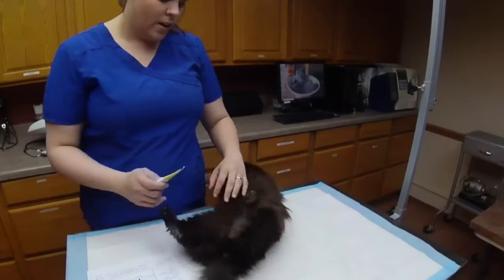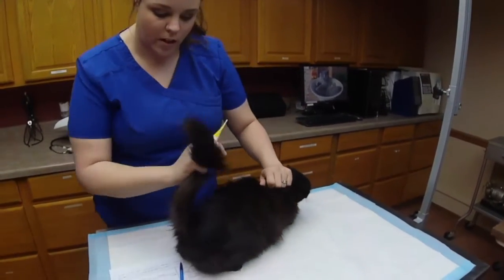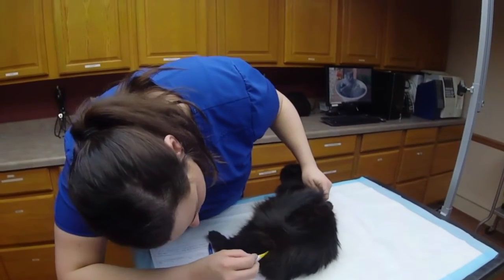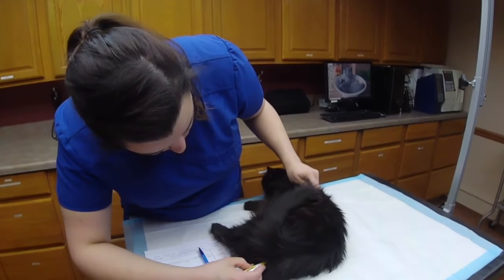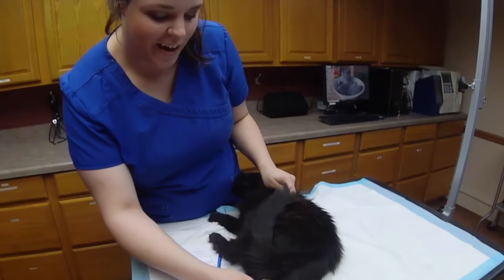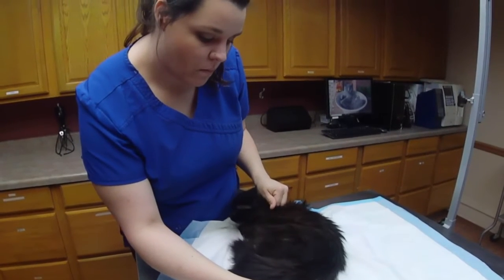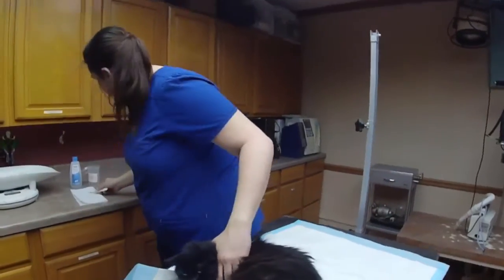Though she is friendly, this part may be a little bit stressful to her. So what you're going to do is hold her tail and scruff her. I know. Though it's a fast thermometer, it started out at 90, so we're climbing slowly. I know, Miss Samara. I can let your tail go. Oh, she is at 100.2. So I will write that down.